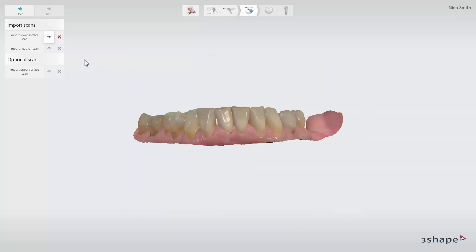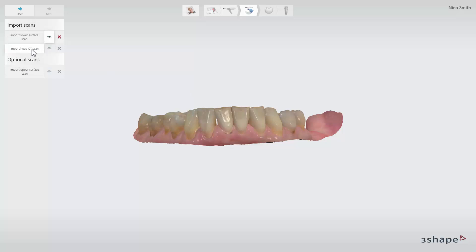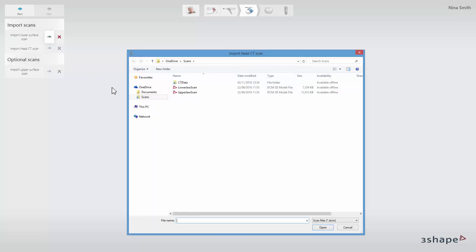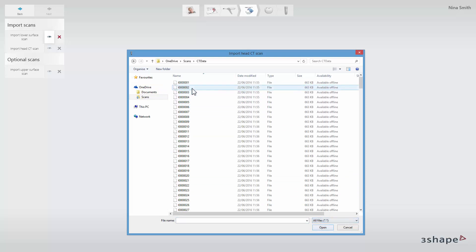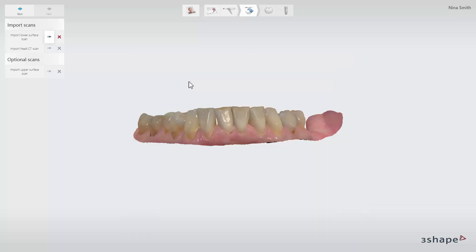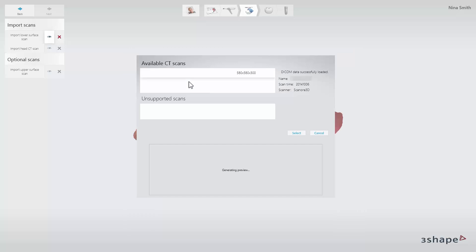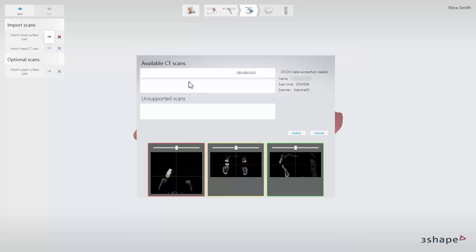To import the CT scan, click Import Head CT Scan and select only one of the DICOM files in the folder. This will automatically import the full CT scan. Implant Studio supports all open DICOM file formats which comply with the 3-shape DICOM conformance statement found on our website.